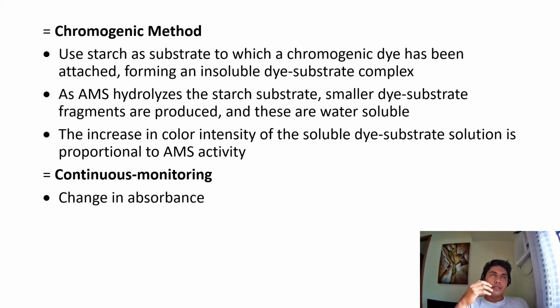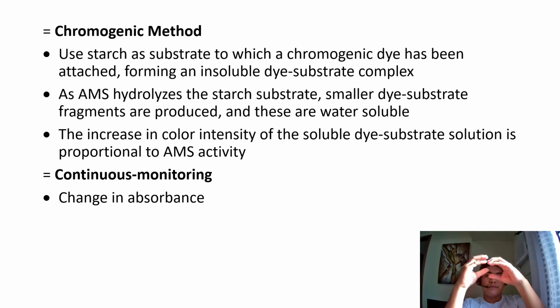Once this substrate is hydrolyzed, it will produce smaller fragments of the dye, which is water soluble. And since it's water soluble, it will give color. So if there's increased breakdown of the substrate, there's also an increase in the color intensity of the solution.